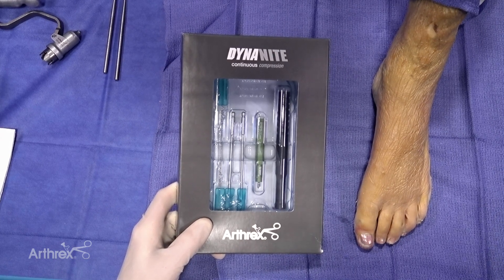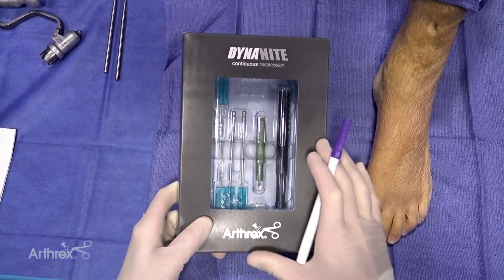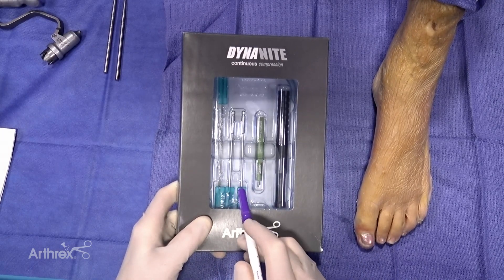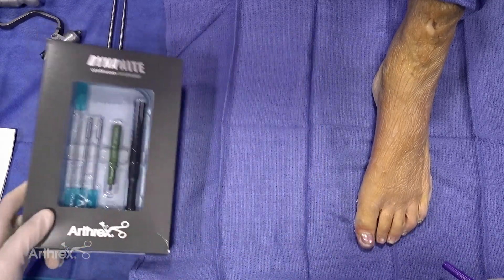Hello, today we're demonstrating the use of the Dynanite PIP implant for hammertoe correction. This comes in a sterile kit ready to go in the OR, which includes everything from the guide wires, a couple of different sizes of drills, the implant with the inserter, and also a toe tamp. So we'll demonstrate how this is used for you today.